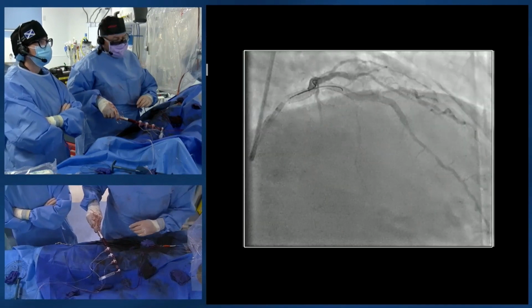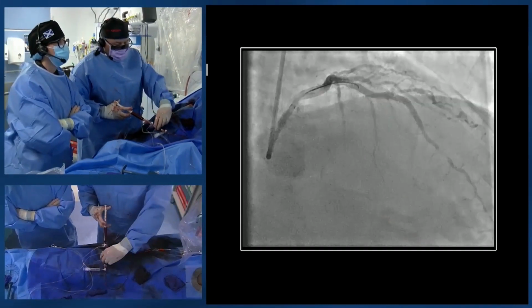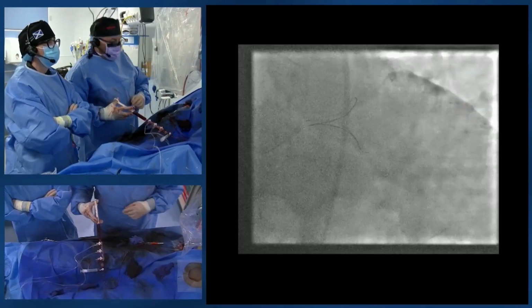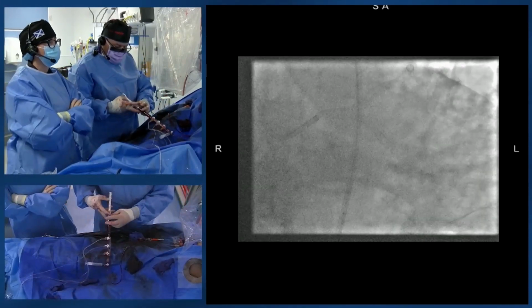Looks absolutely great, hasn't it? Fantastic. So the angiographic expansion looks great. All the side branches have been preserved. The ostium end of the left main looks great, doesn't it? Nice step up into the left main. Held onto the branches, which is good. So that's brilliant. I'm just gonna take the wires out. We'll do our final picture in this view.